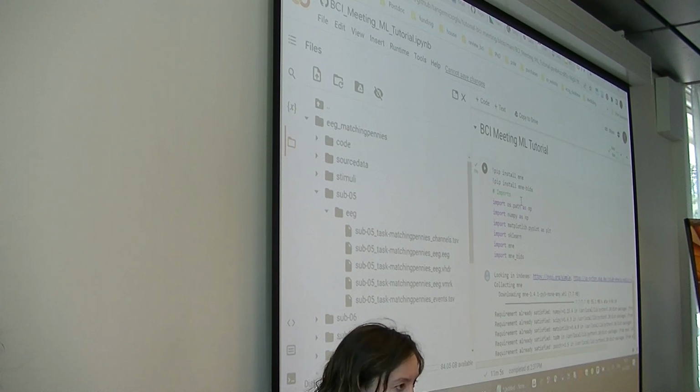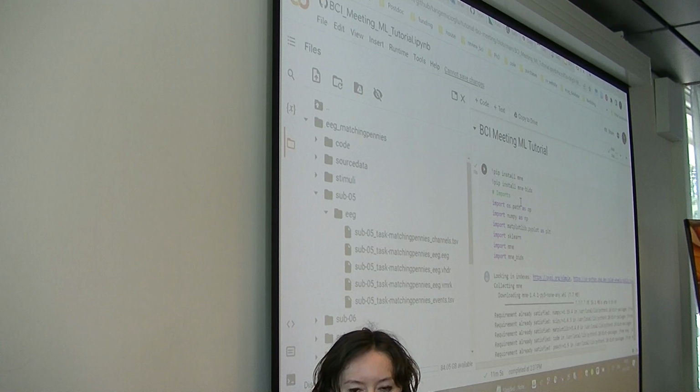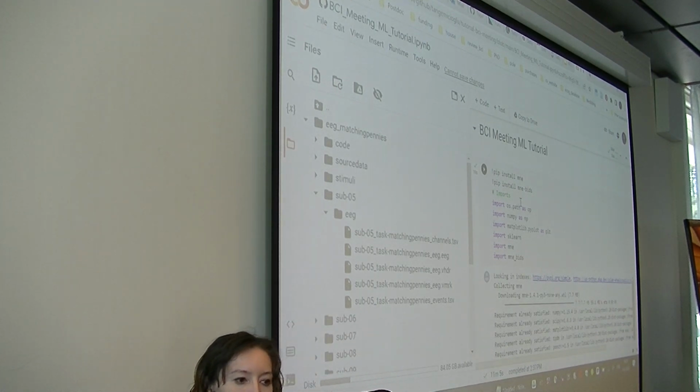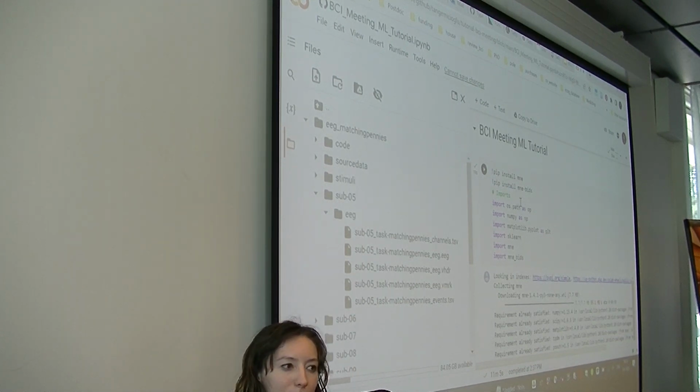If you weren't there when I mentioned at the start, we'll be using NumPy, Matplotlib for our plotting functions, and scikit-learn for our main machine learning tools. Scikit-learn is generally the lightest of machine learning libraries, and it typically constitutes what's called traditional machine learning, which is most of the methods that were used before the current rise of deep learning.